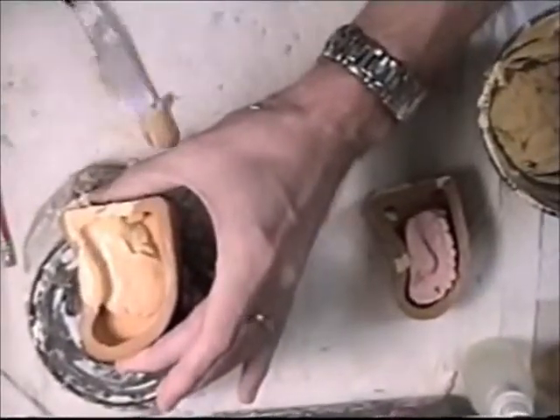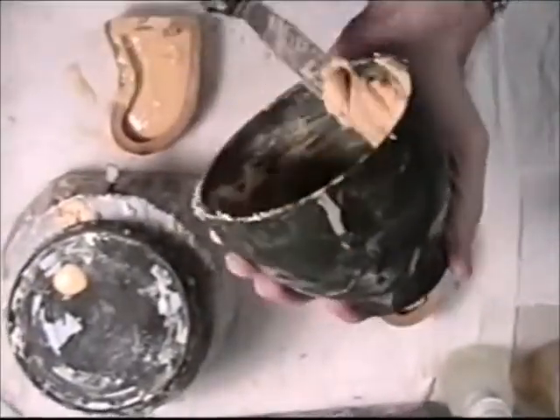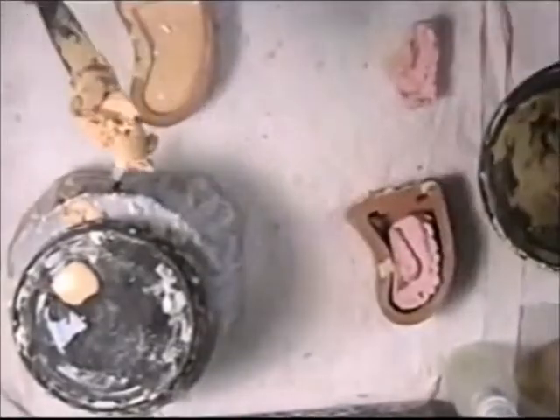The stone is starting to get hard — I don't know if I'll be able to do both of these. The good thing about the opposing is you don't actually have to fill them to the top. Looks like I'll be able to get one more, and then I'll have to mix up a little more stone to get the last one here.